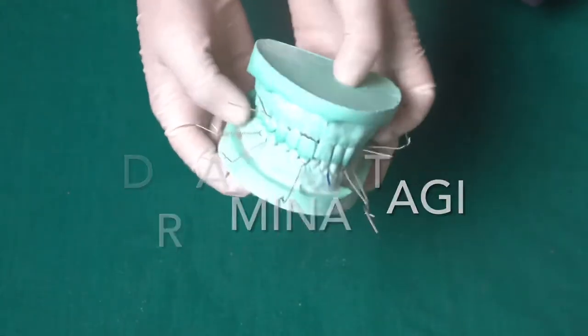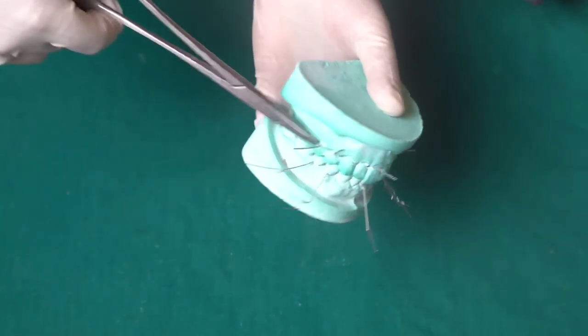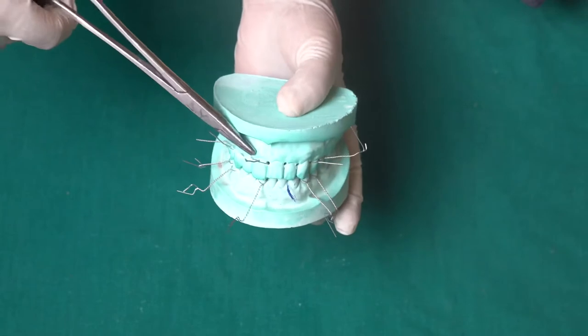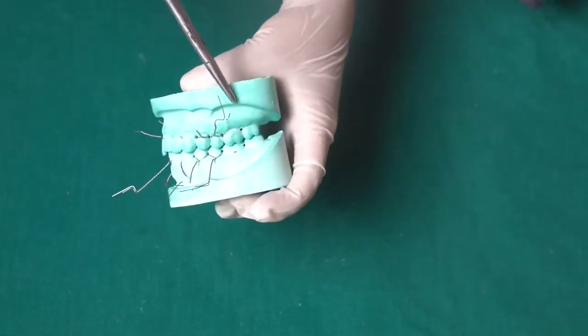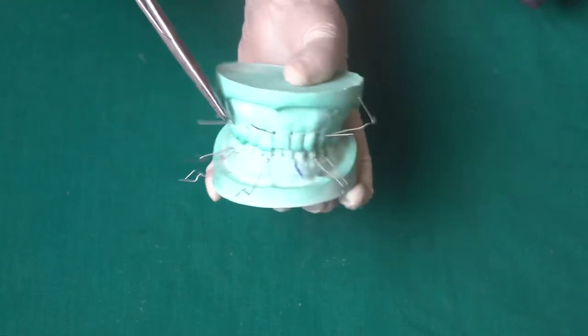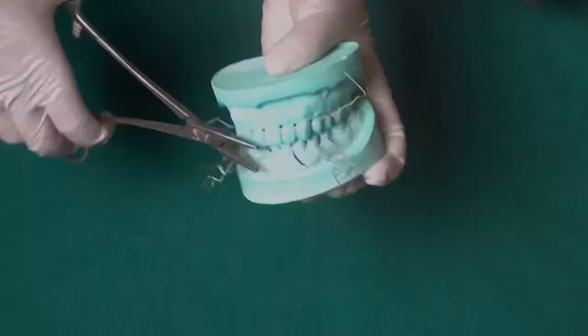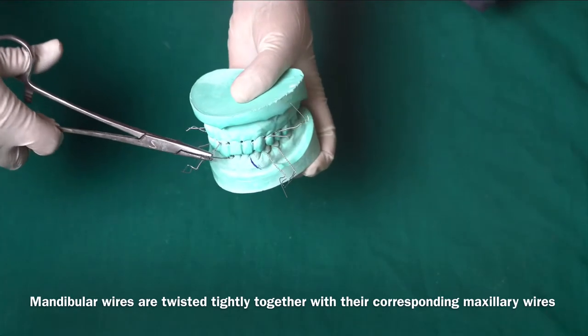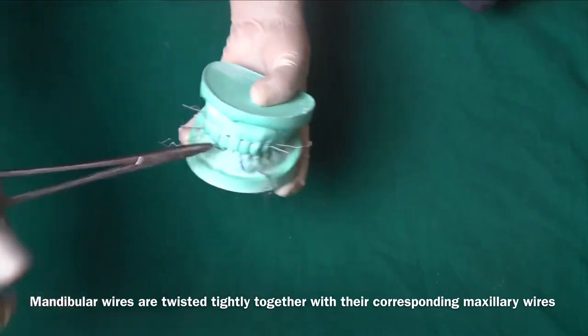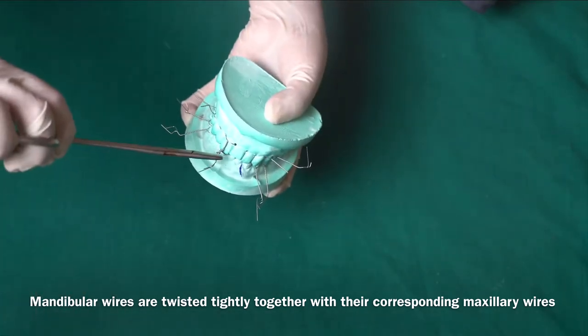The same teeth we are going to take in the maxillary region as well. If I have taken a mandibular premolar, then again in the maxillary region I will take the premolar tooth. Again at the central incisor I am going to take the maxillary central incisor, and again the maxillary premolar, so that I can tie both together and form an intermaxillary fixation.